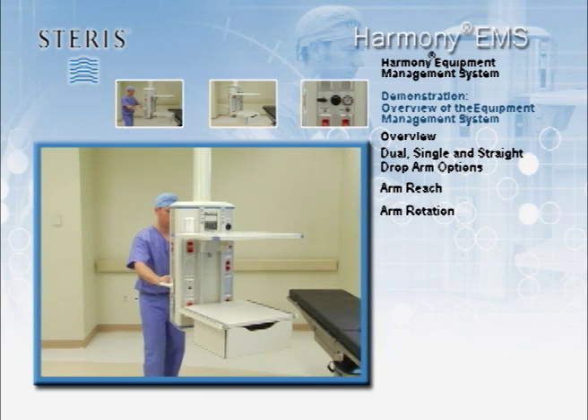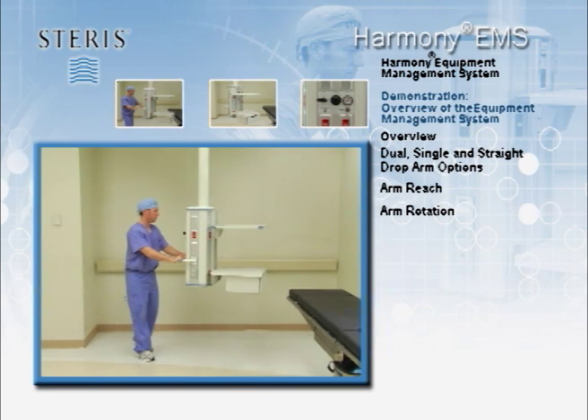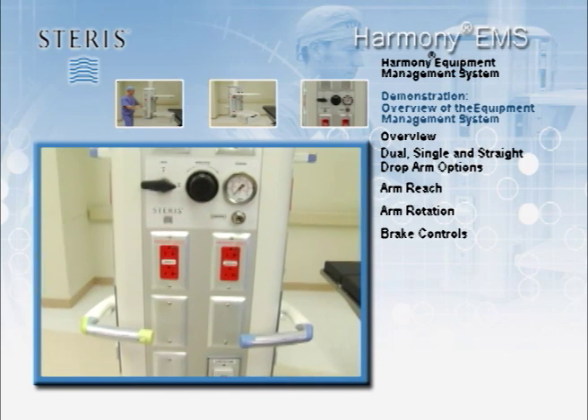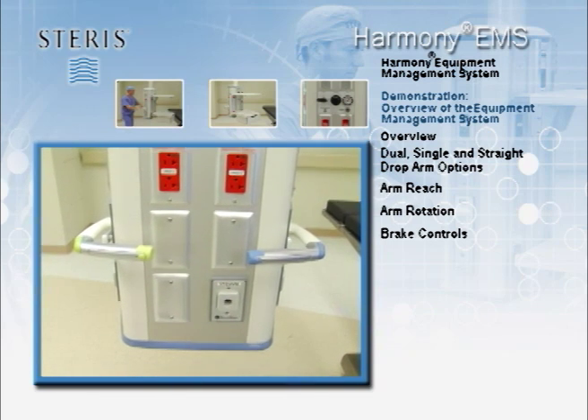Arm systems rotate 330 degrees at the major joints. The suspension system uses rotation stops that are set at the time of installation with the input of the staff to prevent equipment collisions. Harmony EMS systems are equipped with standard pneumatic and friction brake controls. To maneuver the column, one can choose to position the upper arm, the lower arm or both arms at the same time.